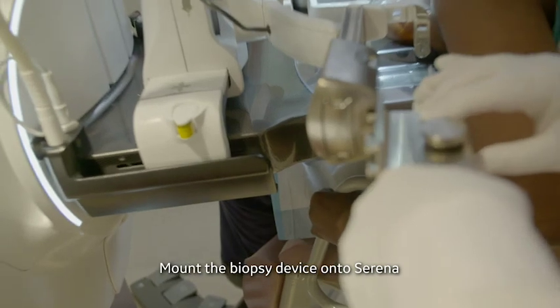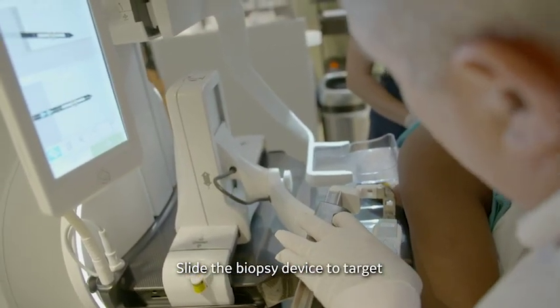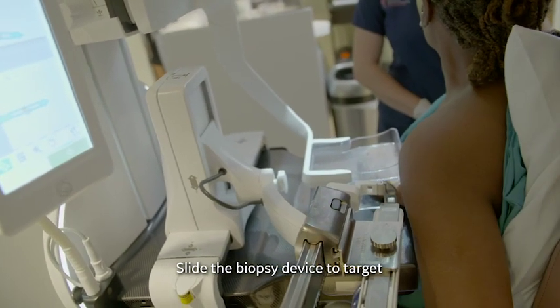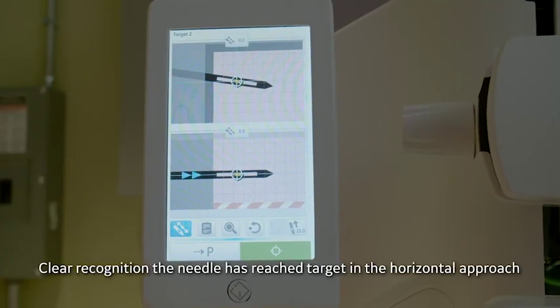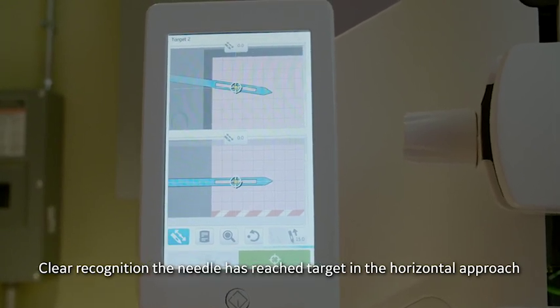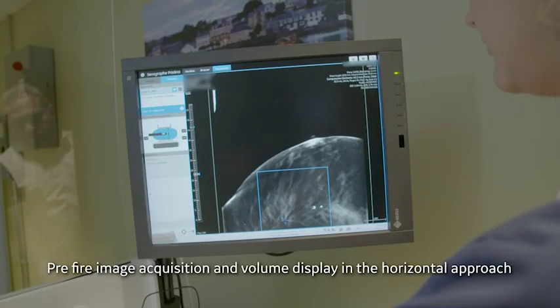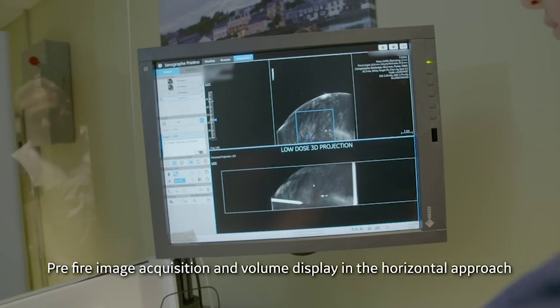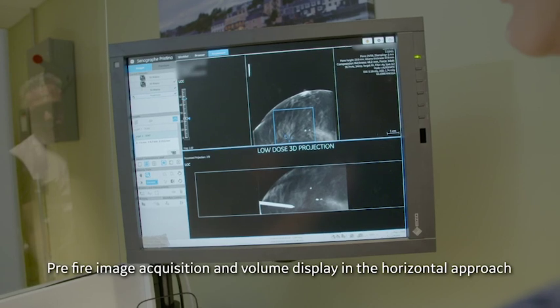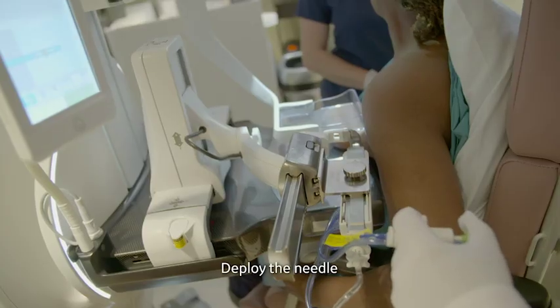The needle is mounted onto Serena and slid down to the target location. The radiologist knows he's at target because on the touchpad the needle turns from black to blue. When the needle is blue, we are at target. A 3D acquisition is then performed for pre-fire imaging to verify that the needle and target are aligned.